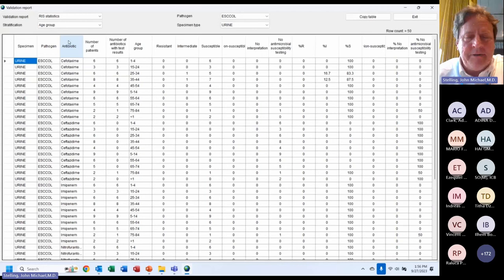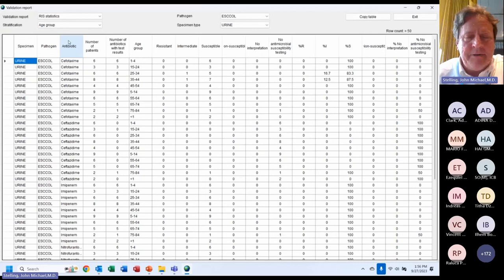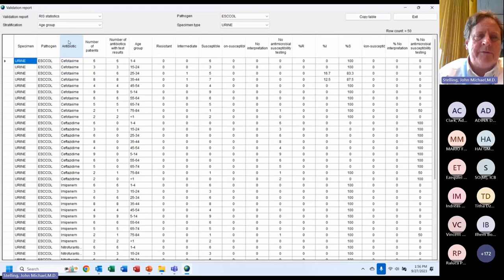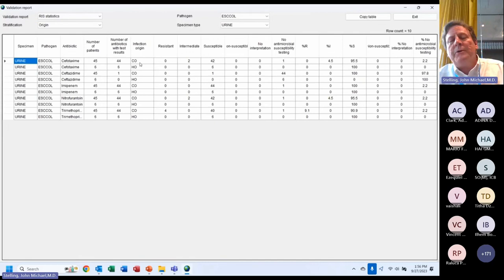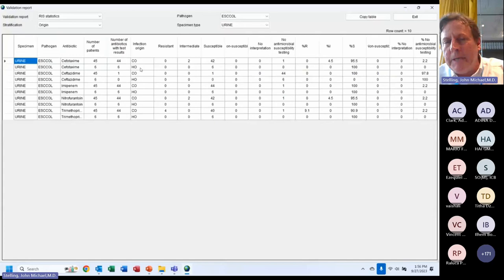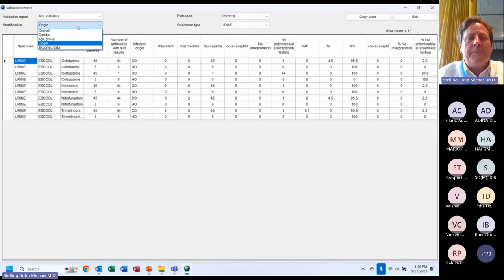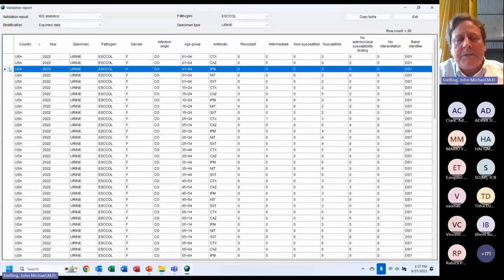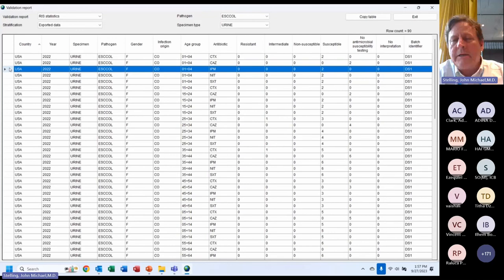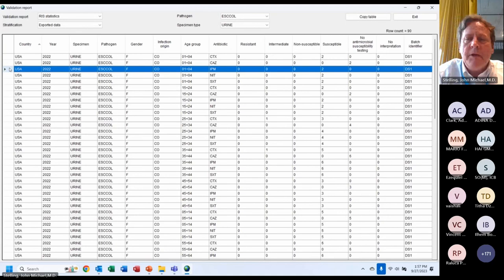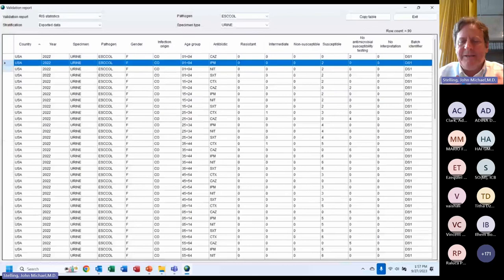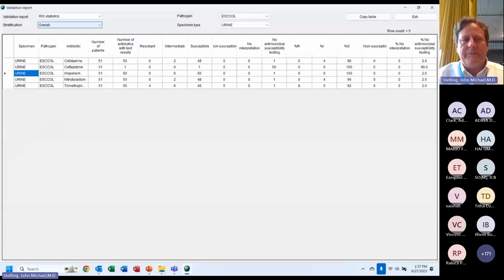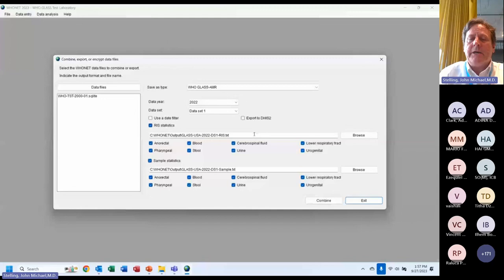Clicking on 'Origin' shows CO (community origin), HO (hospital origin), or UNK (unknown) — either because we don't know if it's inpatient or outpatient, or we know it's inpatient but don't have the date of admission. At the bottom, the 'Exported Data' view shows the actual GLASS file: every row has an organism, specimen, year, gender, infection origin, age group, antibiotic, and the numbers in those categories. For validation purposes, people usually focus on validating the overall total numbers and can copy-paste to Excel.